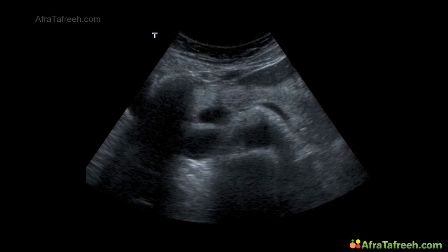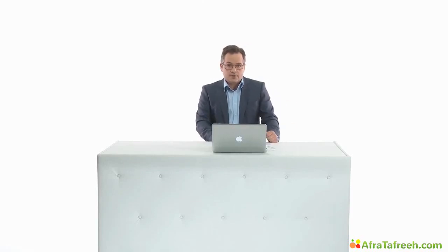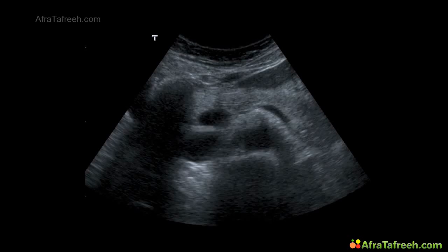Maybe an older patient with an increased echogenicity. And once again, this was the picture I've shown you at first. Our guiding structures: splenic vein, IVC, abdominal aorta, pancreatic duct, and pancreas. This was my learning curve when I started doing ultrasound examinations. Now we have a really good view on this pancreas, on our hidden organ.